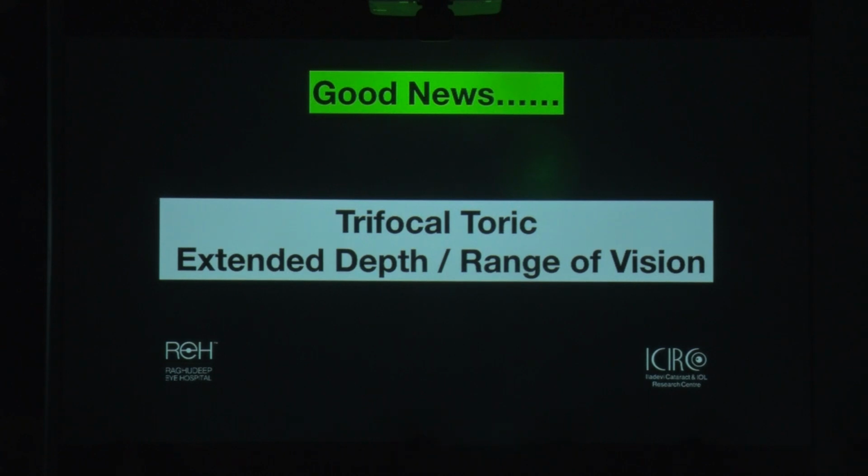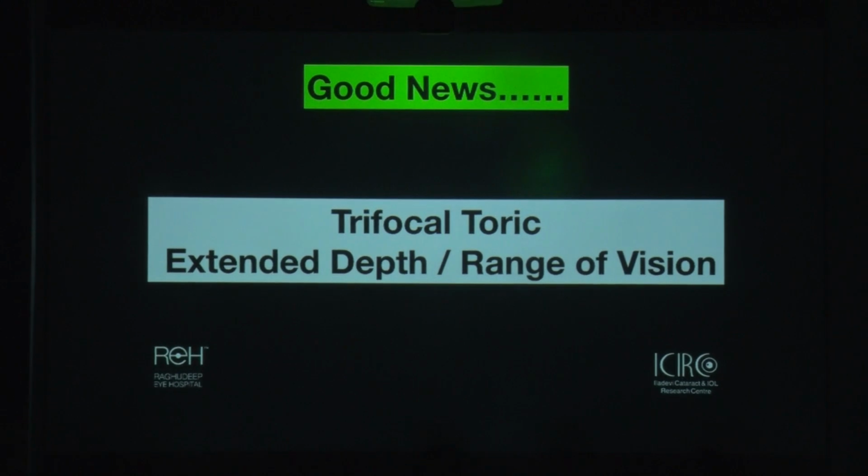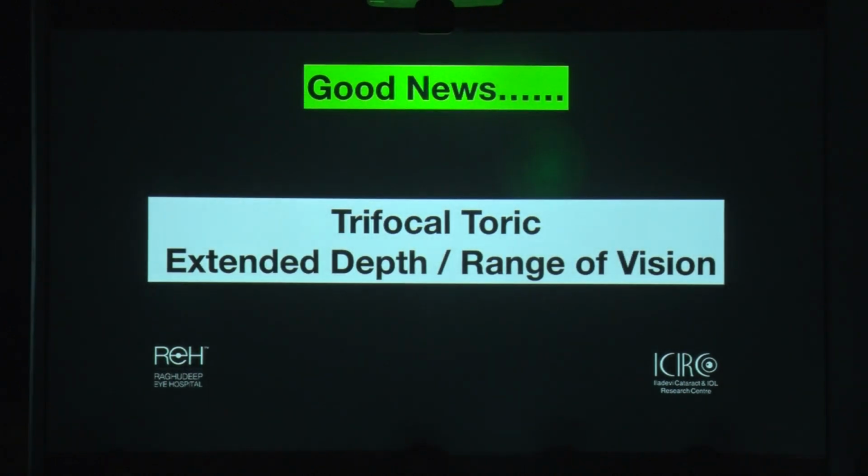If somebody is very, very particular in terms of their personality, or if their eye has something which is not exactly within ±2 standard deviation, then I would go for an extended range of vision IOL and astigmatism correction. I think there are negligible side effects, and I'm sure everybody on the panel will agree that the glare, the halos, the waxy vision have not gone away, but they are not so much of a bother for us that we hesitate in suggesting these lenses to patients.